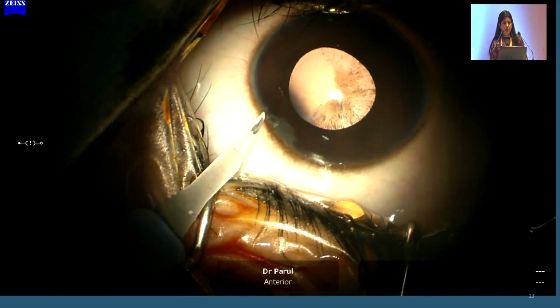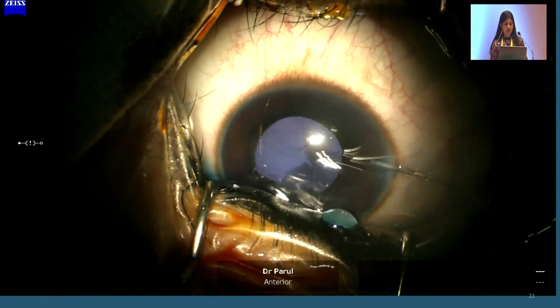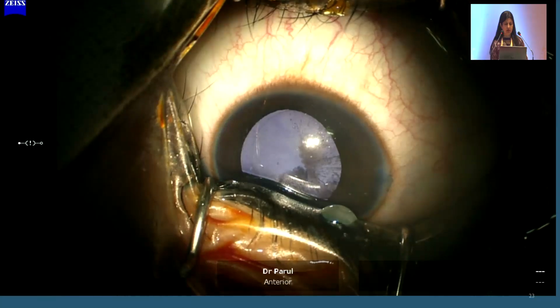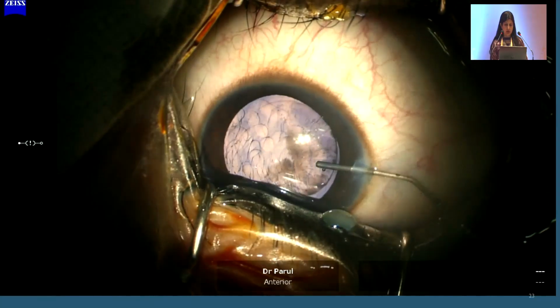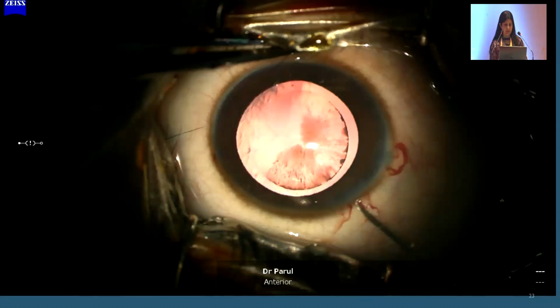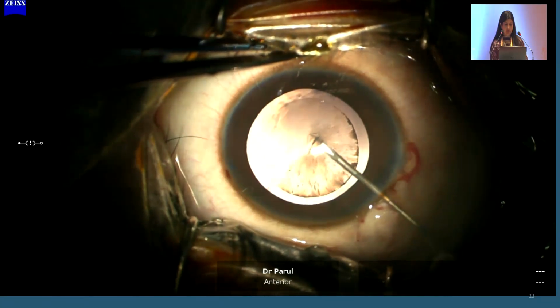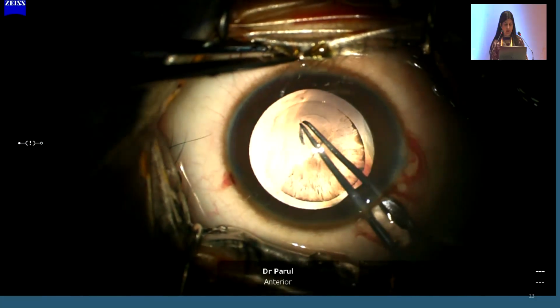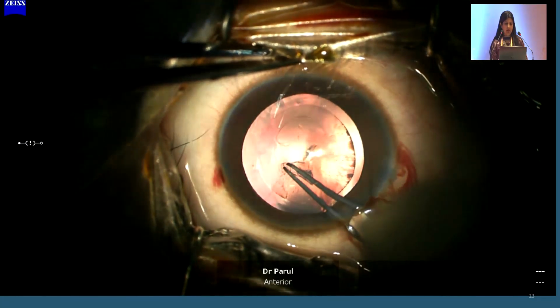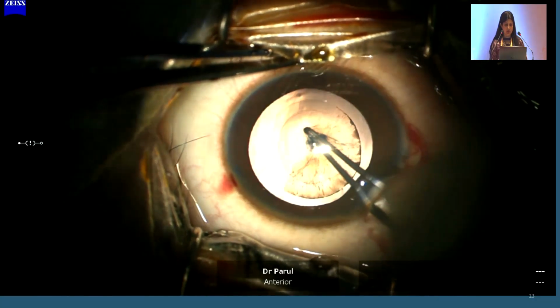This is another video in which we show we had put intracameral mydriatics. After staining the capsule, we put the intracameral mydriatics. That is a combination that is available nowadays. And you can see how beautifully the pupil dilated. The rest of the steps are same. We have to re-grasp the anterior capsule again and again because there is a tendency of going outside.